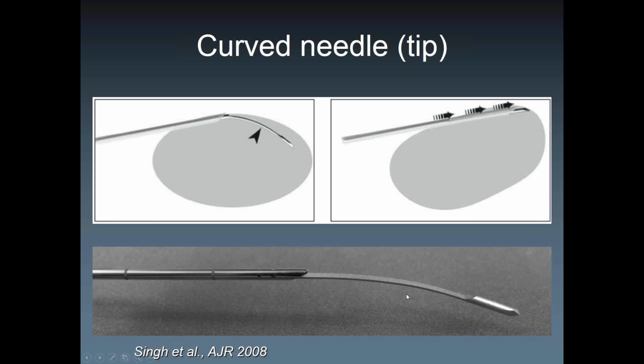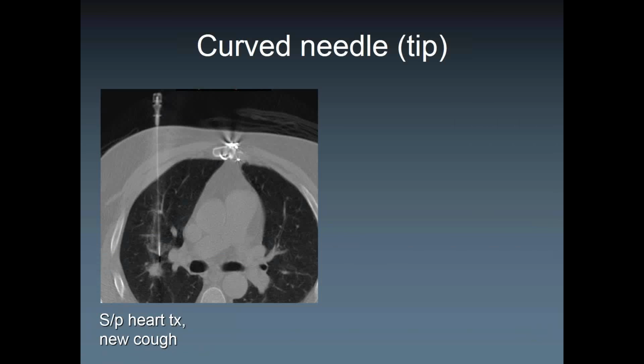The important thing is if you bend it too much, the distal portion is going to rip through tissue, obviously, and it's going to end up with no target tissue. So the proximal portion is going to be the one that has tissue, or the other way around. If this is not within the target, only the distal portion will have target tissue. So it takes some practice and a few cases, and you'll see that it can help you in a few situations.